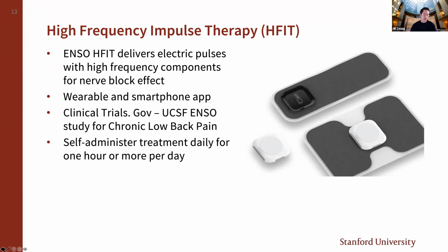I like my Apple products, and I'm sorry for advertising about that, but I like my iPhone and tech devices and things like that. And so with this device, you can actually have an app for it as well, and it'll help time and track when you self-administer the treatment for an hour or more a day. I don't know more about the clinical trial than what's on clinicaltrials.gov, but I would assume that you administer the treatment for an hour or so. You probably can do it a few times per day, and then they track and see what your function and your pain scores are like.